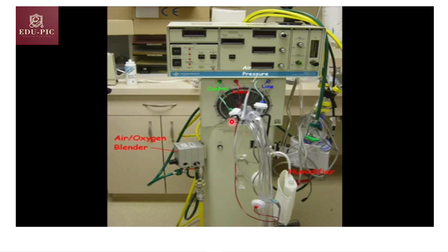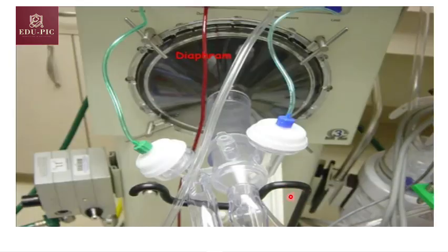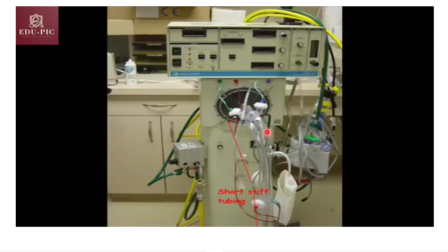These are other parts of the high frequency oscillatory ventilation machine. This is an air oxygen blender, and these are some lines. Here is a humidifier, as you can see. Here is a piston positioning, and here is the power on and off. Here is a diaphragm for a piston.